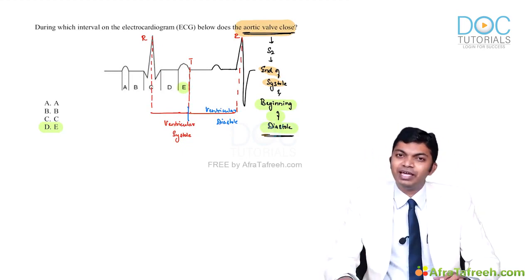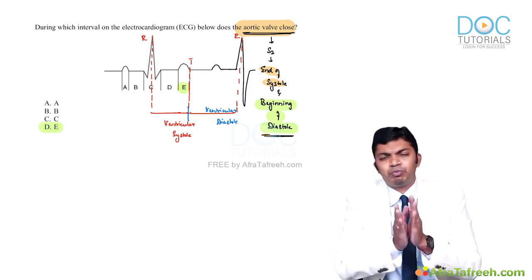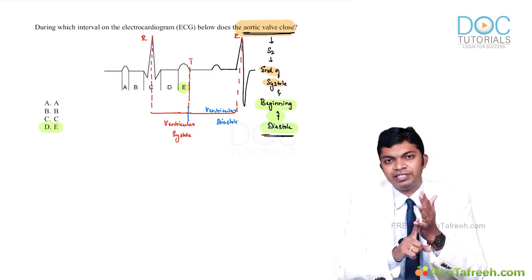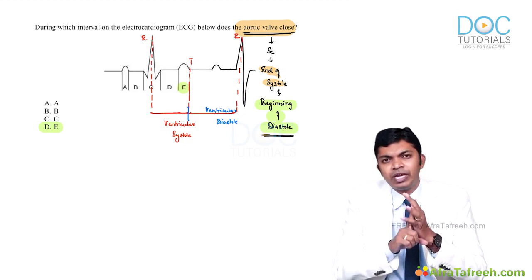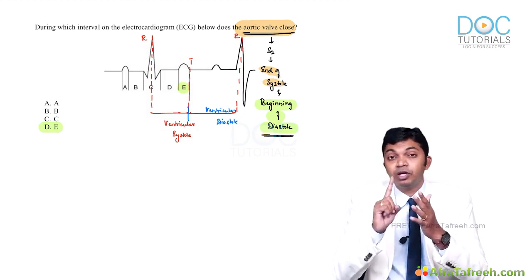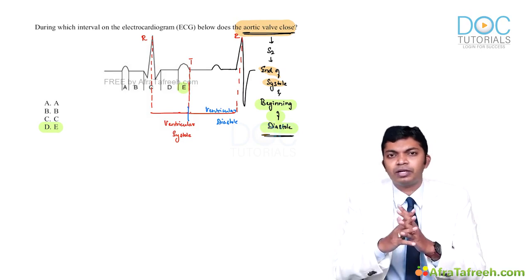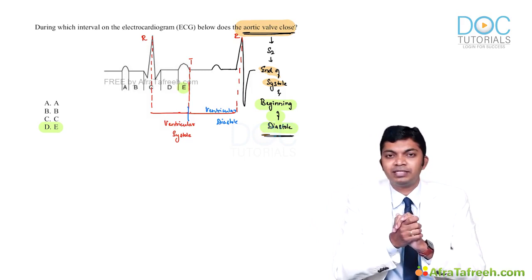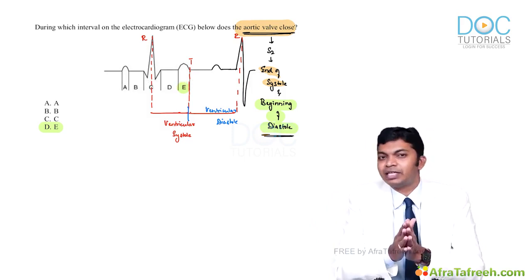That completes our ECG related topics. You have to be very familiar with a few points. Always remember, axis is crucially important in ECG. T wave, mid myocardial cells, again a very important topic in ECG. Q wave in ECGs. These three are extremely important, and so is the QT interval when it gets applied to cardiology and medicine part of ECG, doctors. So, that completes our ECG basics as well as axis calculation.